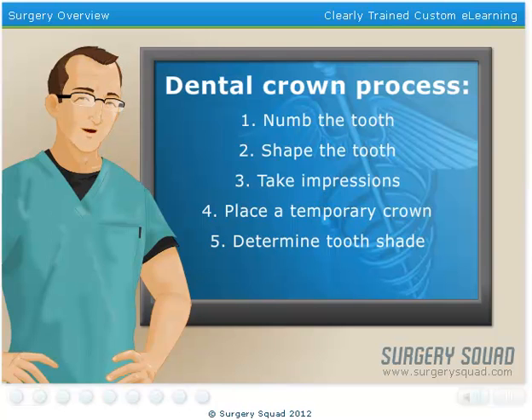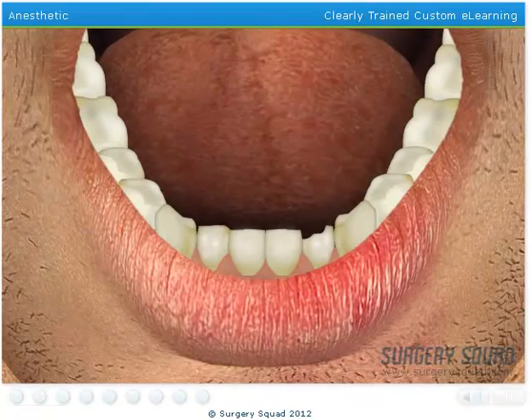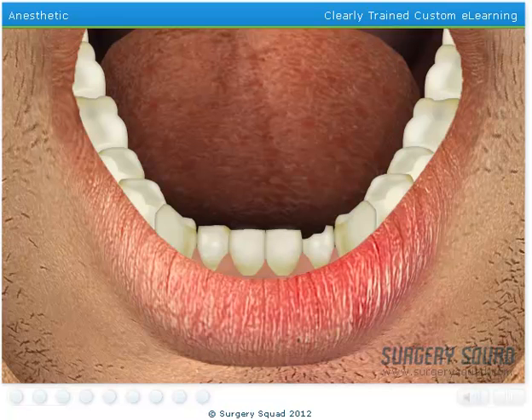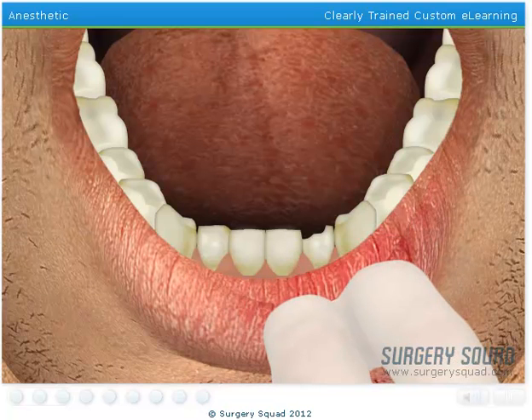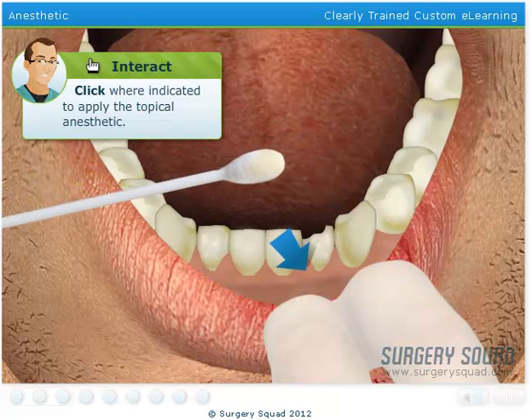When our patient returns for their next appointment, we'll place their permanent crown. Now let's put on our gloves and get down to business. First, place some topical numbing gel on the injection site. This will alleviate any pain or discomfort the needle may cause.